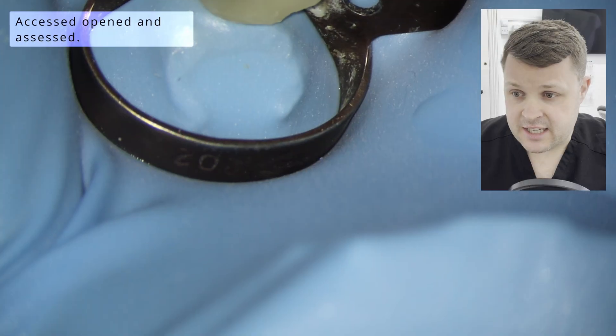You'll see that eventually I did take a CBCT, but probably, if I'm honest with myself, a little bit later than I should have. So let's get into the case anyway. This is a case of a very, very highly sclerosed lower left six.